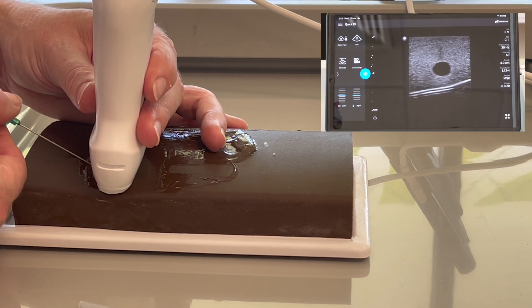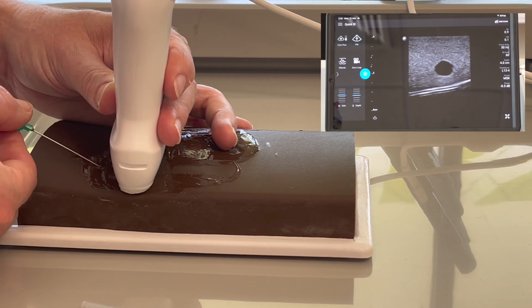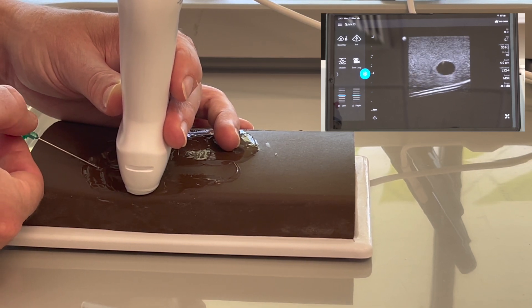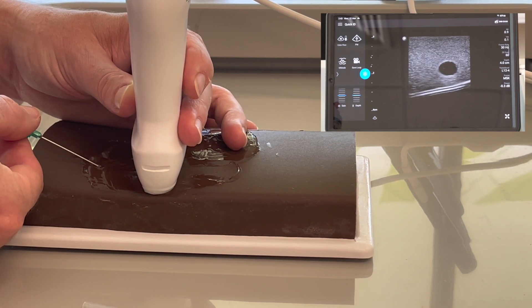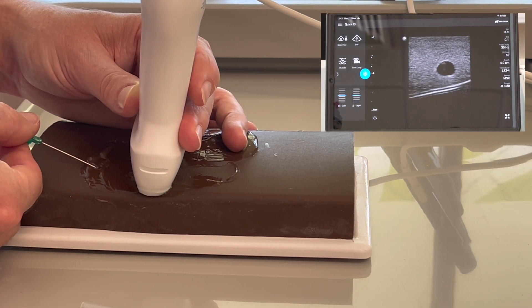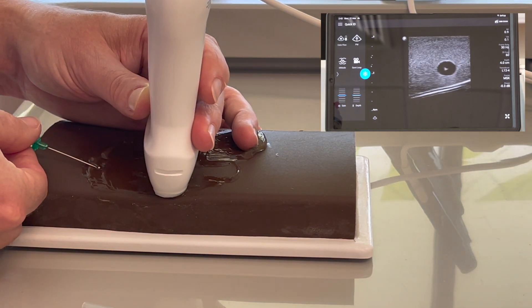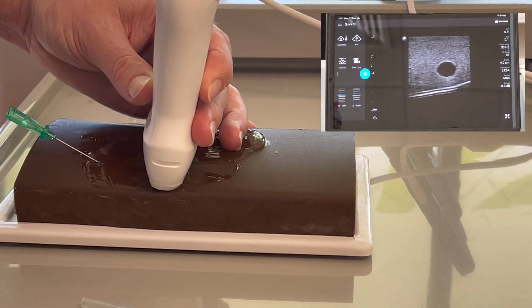We're not just looking for tissue movement — although you can see tissue movement on the screen, you could be well beyond your ultrasound beam. I'm wiggling side to side, and you can actually see that I was well beyond my ultrasound beam. Although we still saw tissue movement, we couldn't say for certain that we were in the center of the vessel. But if you keep following along, now you can. So those are the ways to do the in-plane and the out-of-plane.